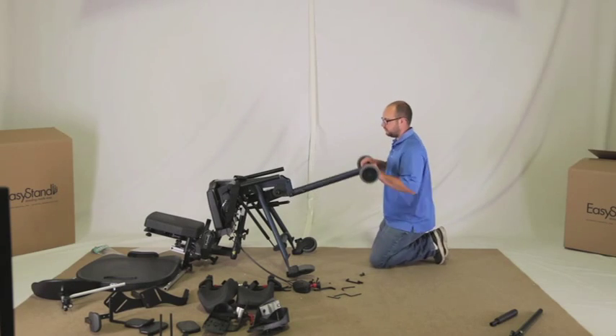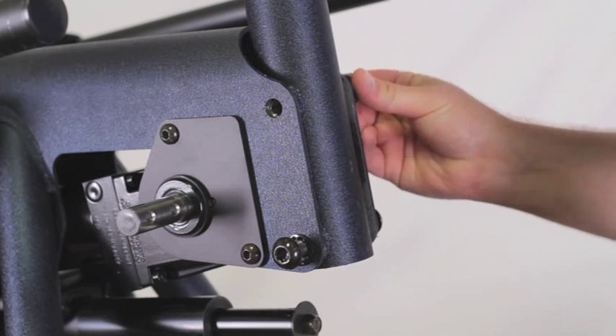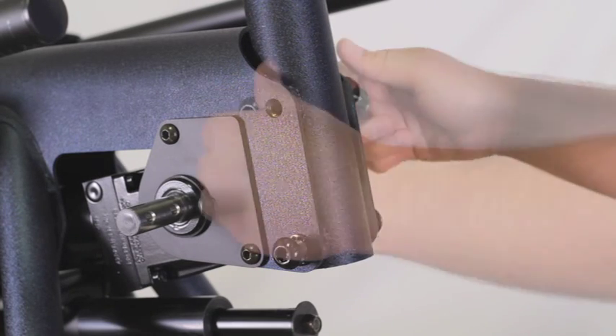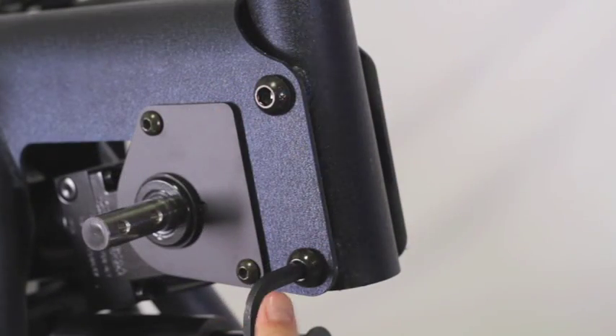Flip the wheel assembly up and insert the two top bolts. Make sure to start all four bolts, then tighten securely.